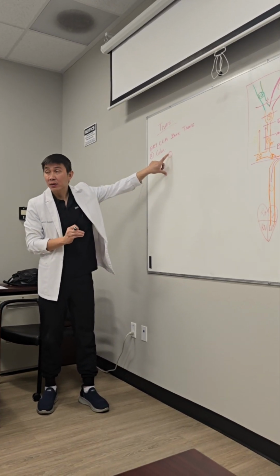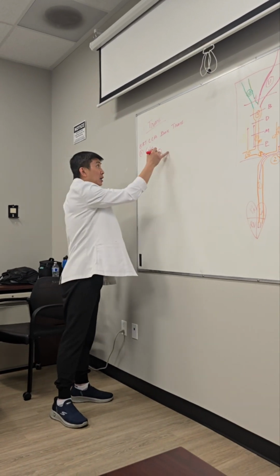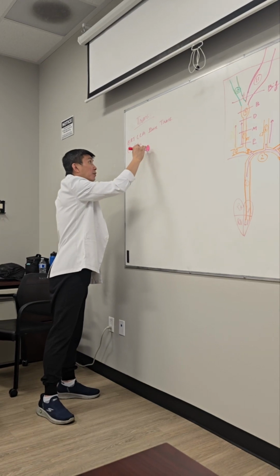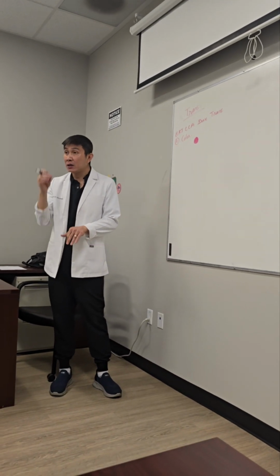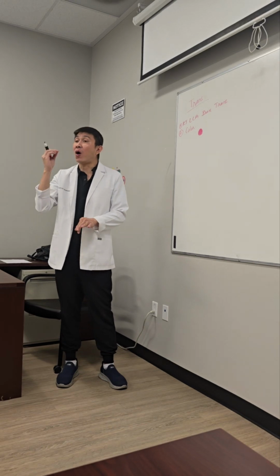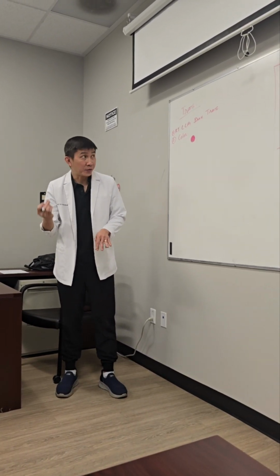That's a must. And then when you turn the color on, the color has to fill completely inside the vessel, because any spot not filling with color is going to be suspicious for calcification, for a blood clot, for stenosis. That's the reason.